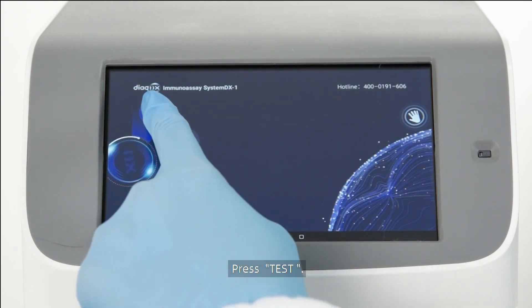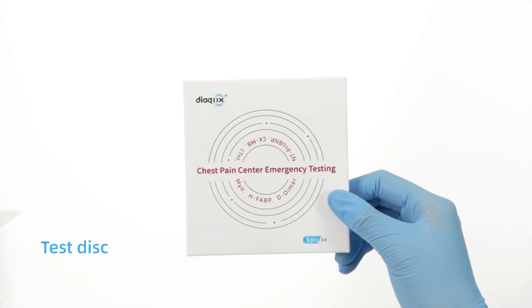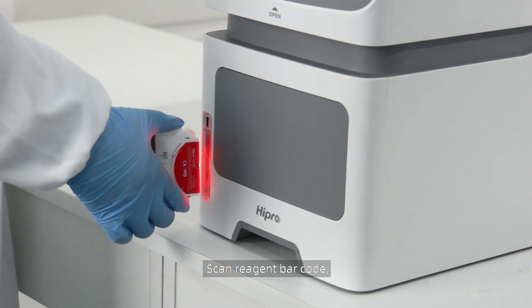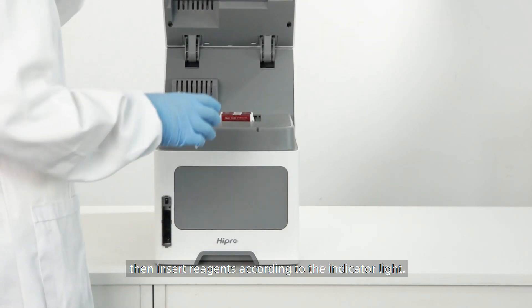Press Tests. Scan the reagent barcode, then insert the reagents according to the indicator light.